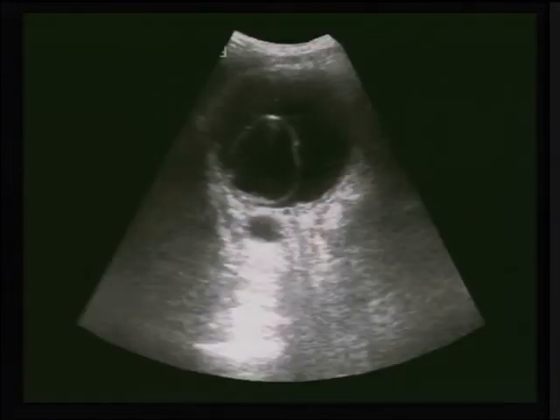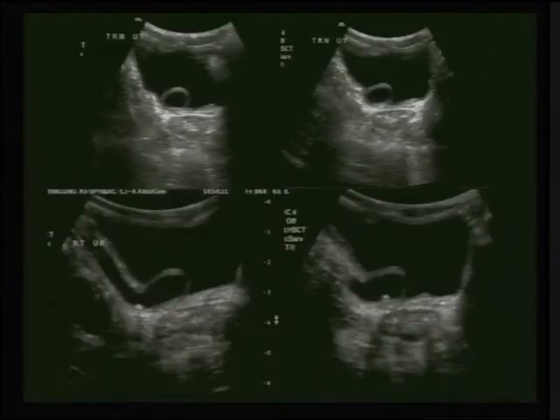You are going to see it by ultrasound. Sometimes when you do ultrasound, you may not see the ureterocele in the beginning. If you are thinking of ureterocele, or you have a history, or you have a VCUG which has shown ureterocele, just wait for a while. It will be filled with urine, and it will look like a cobra head which is projecting within the urinary bladder. This is another example which is showing hydroureter, ureterocele, and there is a small calculus within this ureterocele.